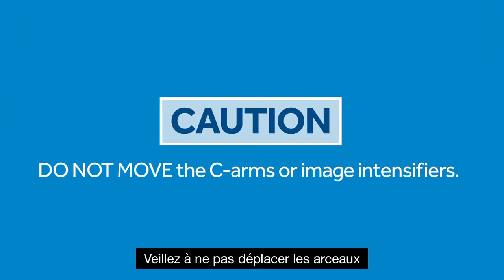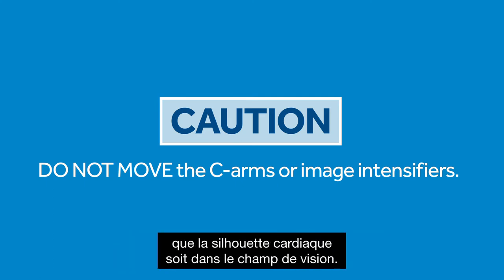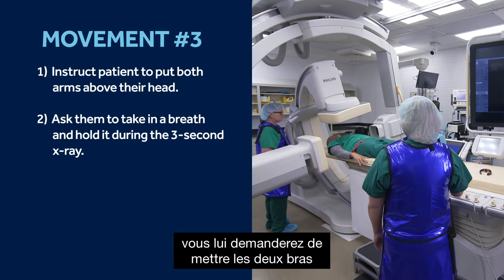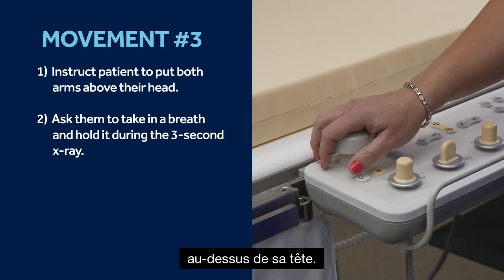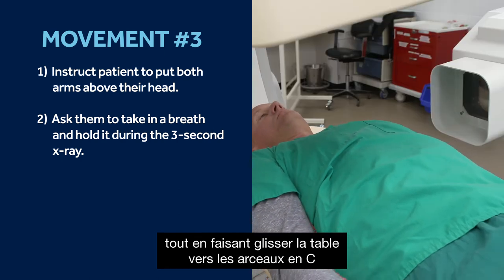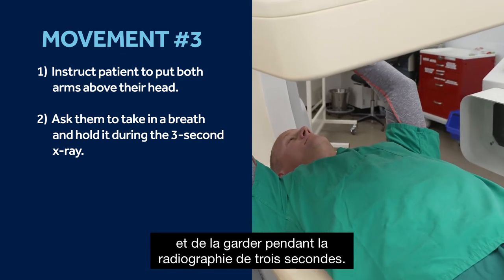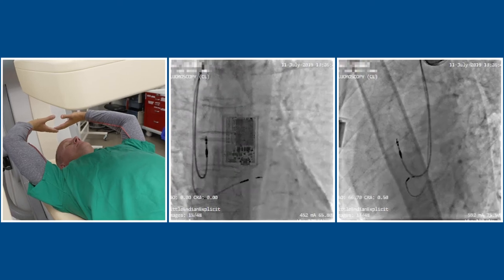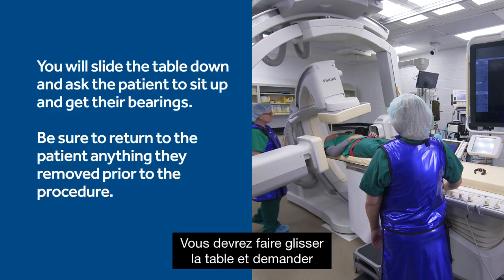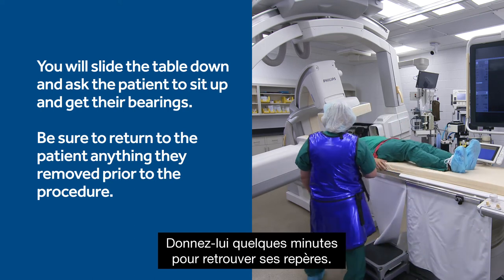Please take care not to move the C-arms or image intensifiers. You are allowed to translate the table only so that the cardiac silhouette is in the field of view. For the third and final acquisition, instruct the patient to put both arms above their head. Tell them the table will move as you slide the patient table towards the C-arms to move the heart into view. Ask the patient to take in a breath and hold it during the three-second x-ray. That will conclude the patient involvement. Slide the table and ask the patient to slowly come up to a seated position, giving them a few minutes to get their bearings.